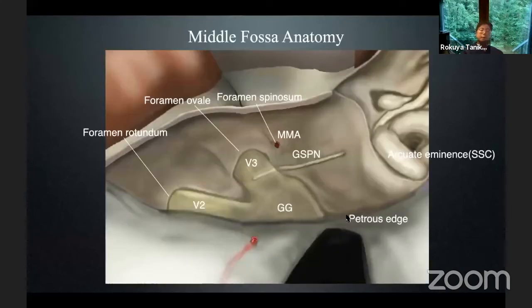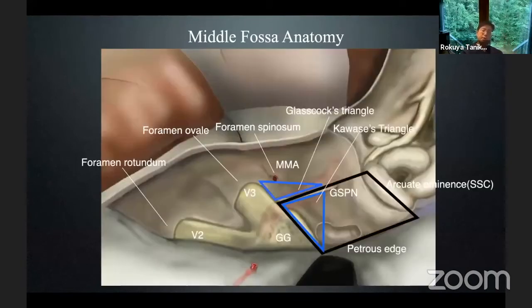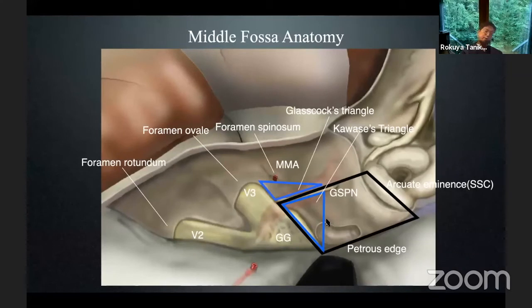Finally, I'll show you middle fossa anatomy. This is middle fossa dural elevation. We must understand the Glasscock triangle, the Kawase triangle, and the temporal rhomboid: V3, GSPN, arcuate eminence, and petrous ridge. The temporal rhomboid is very important. The internal auditory canal should be skeletonized at 60 degrees on each side.